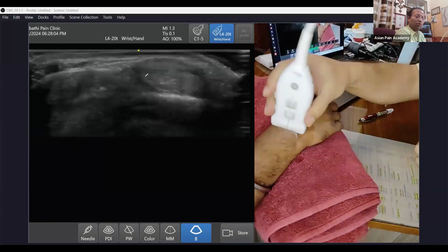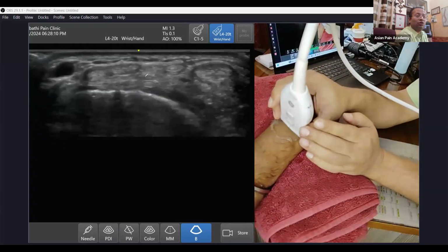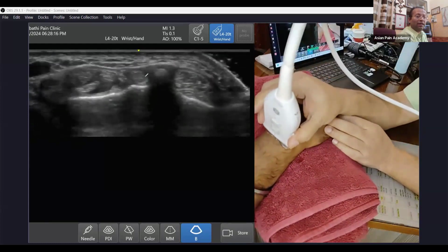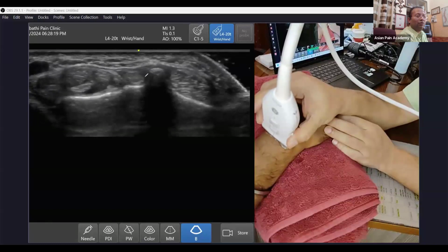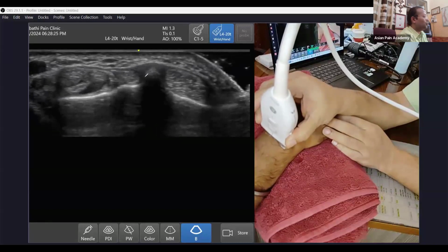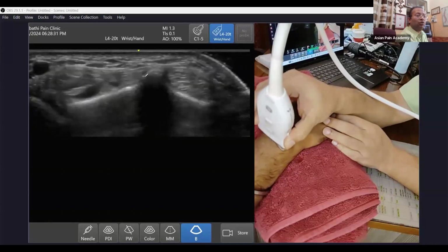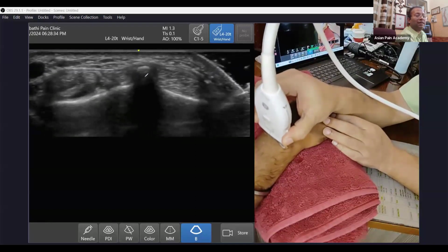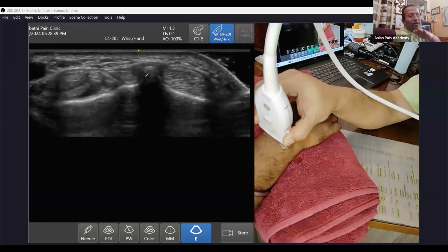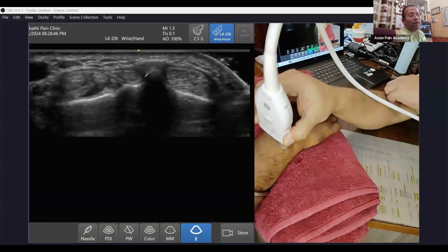So now comes the important pathologies which are related to your this knowledge of tendons. So this is the starting area, the home page. Whenever you are lost, you can come to the home page. So this is Lister's tubercle. Right side it is compartment number 2, and left side compartment number 3. Now as I showed you the picture, ECRL, ECRB is in compartment number 2, and it is always lying below, straight coming and lying below, and it is traversed by compartment number 1 and 3.